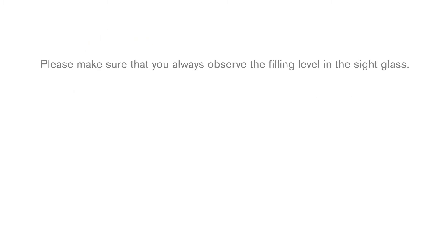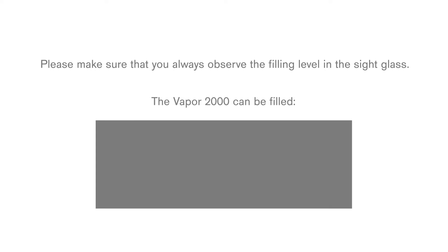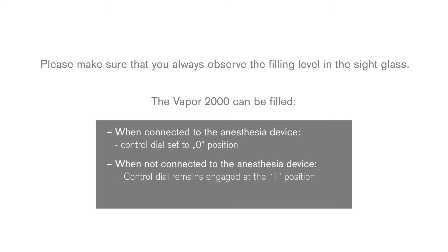Please make sure that you always observe the filling level in the sight glass. The Vapor 2000 can be filled when connected to the anaesthesia device and control dial set to 0 position. When not connected to the anaesthesia device, the control dial remains engaged at the T position. Filling during operation is also possible.